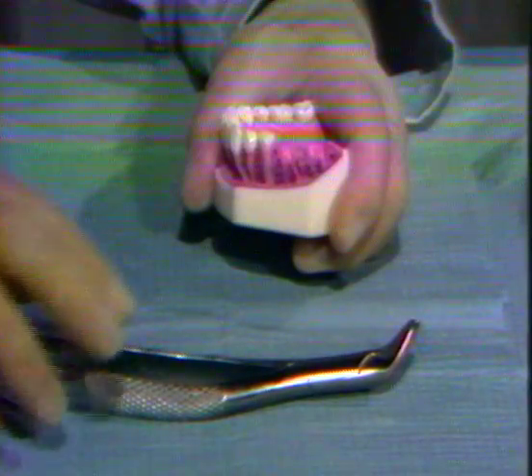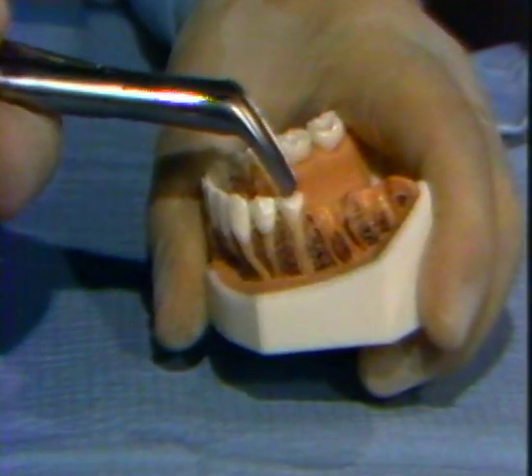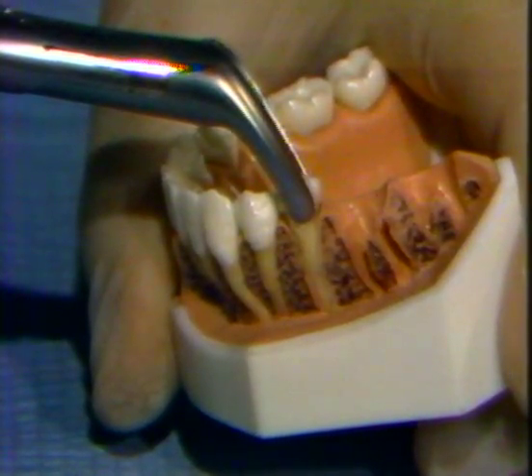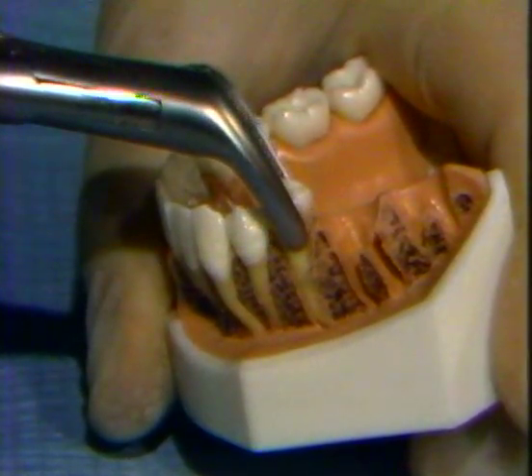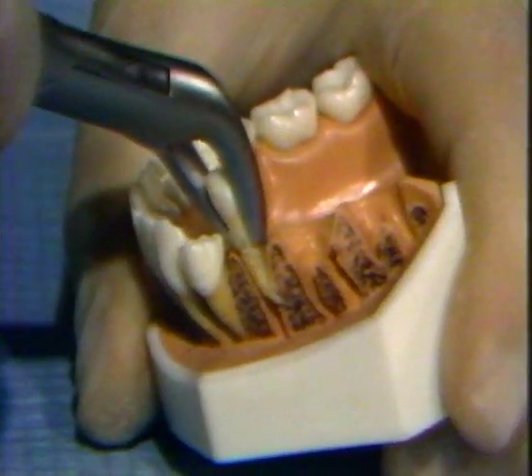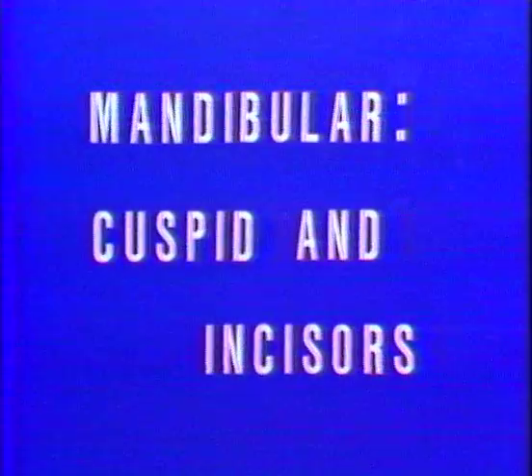Next are the premolars or bicuspid teeth. Luxation movement of these two teeth is identical. After applying the beaks of the number 151 forceps in the proper manner, the first movement is to the lingual, then to the buccal. Then apply rotary movement mesio to buccal and then disto to buccal. The final movement is upward while gently rotating in line with the long axis of the tooth.